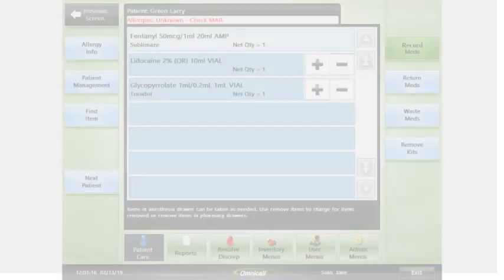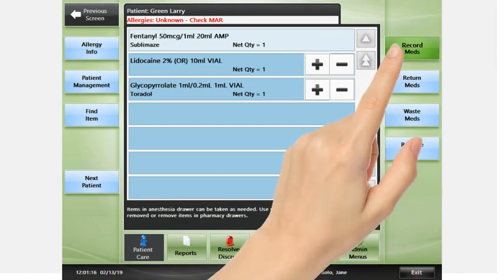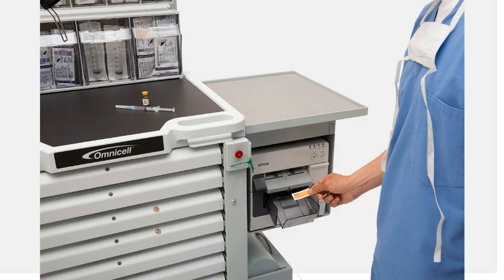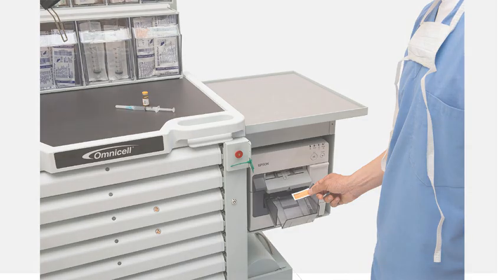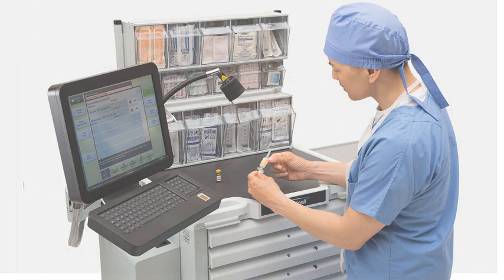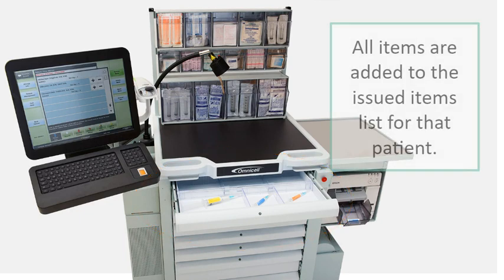If you selected an item stocked in an anesthesia drawer, the button may be labeled Record Meds. If an item requires a label, one will print. Attach the label to the syringe. Place items into your designated anesthesia work drawer until you need them. All items are added to the issued item list for that patient.